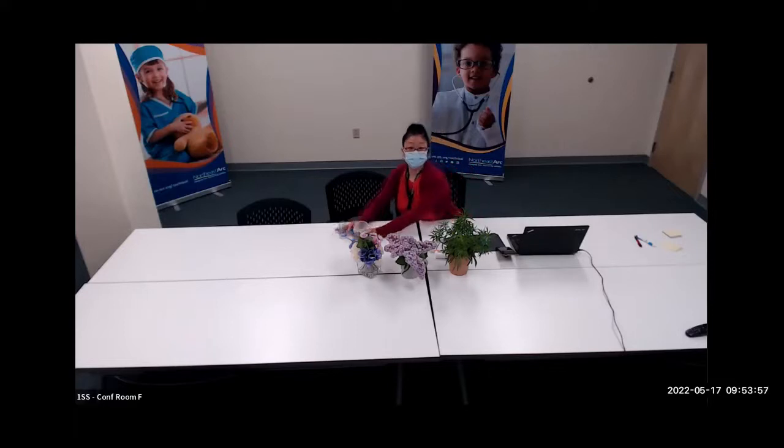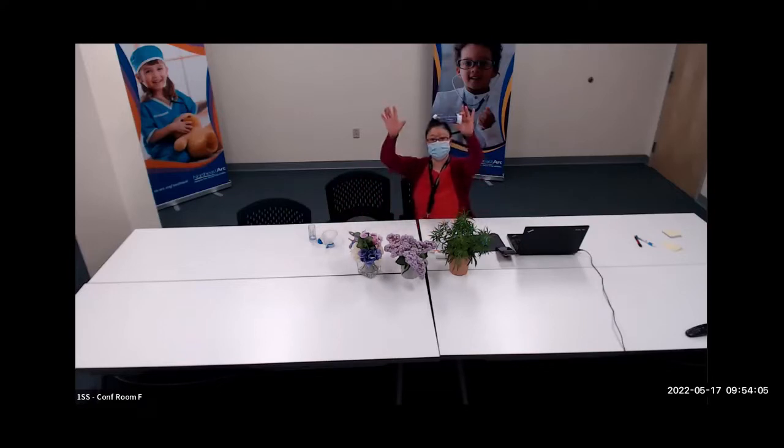But if you do have a spare at home, it would be a good idea every week just to give them a wash, give them a rinse, and let them dry overnight. This is another one you might see, the Philips OptiChamber, also a spacer, similarly used. It comes apart in 3 pieces as well. In this case, 1, 2, 3. They come apart the same way. Clean it exactly the same way.